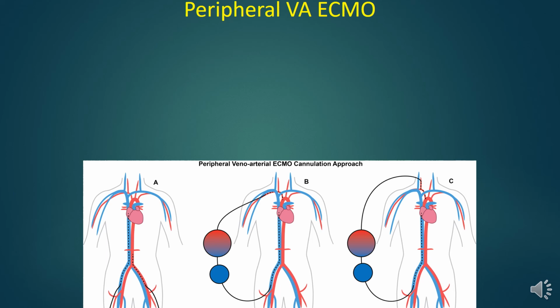Lactic acid and urine output are treated as markers of end-organ perfusion, and serial echocardiography is utilized to monitor native cardiac recovery. A number of complications should be anticipated while on VA ECMO. These complications and potential maneuvers to address them include LV distension, north-south syndrome, and limb ischemia.